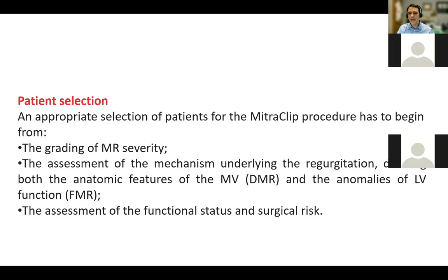And some of the things we look at are bicommissural view, for example, where we can see all 3 leaflets, the posterior at each commissure and the anterior leaflet in the middle, where we can see the breadth of the mitral insufficiency jet. Is it only in the middle? Is it on the side? Is there more than one jet? Because that certainly would affect how we would repair the valve.